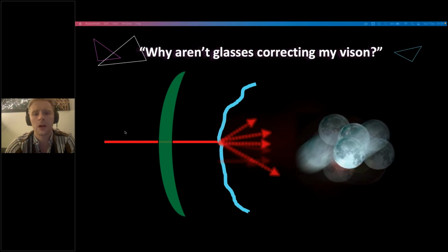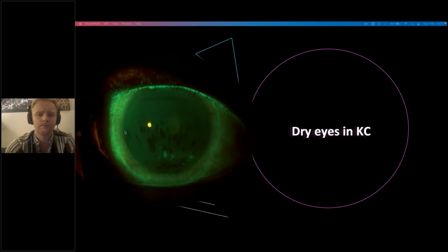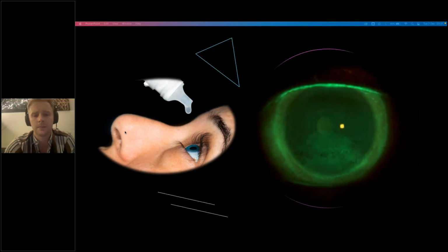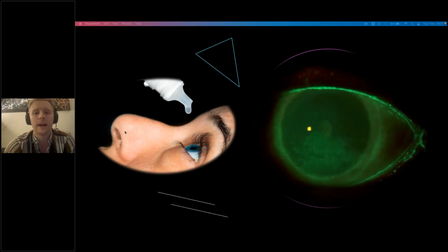This is one of the examples of a dry eye patient with keratoconus, and you can see here how quickly the tears break up. Again, it's a bit like an uneven floor. It will dry unevenly if the corneal surface is irregular. So unless you start using the lubricating drops nice and early, you will just be chasing your tail around. The second the patient blinks, that surface has already started breaking up, and you can see there some of the superficial punctate epithelial erosions. That cornea is never going to refract to 100%, given the irregular nature of the staining. So 5-10 minutes before you start refracting, make sure you've got the eyes well lubricated.